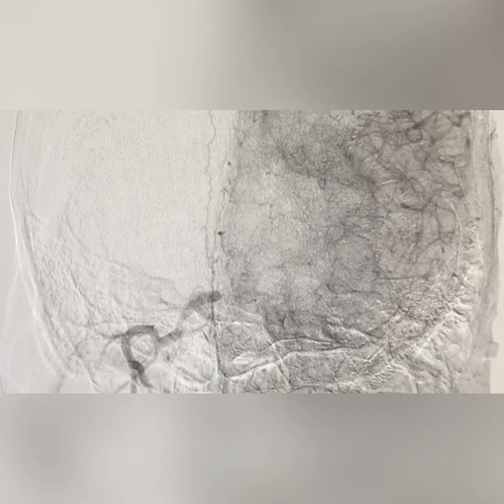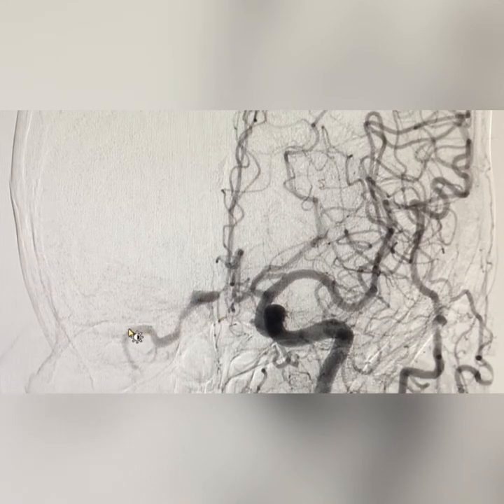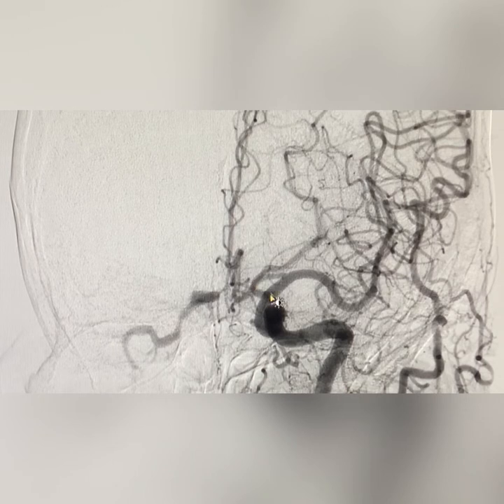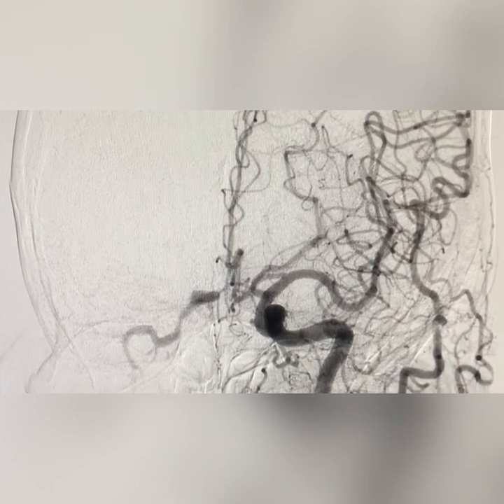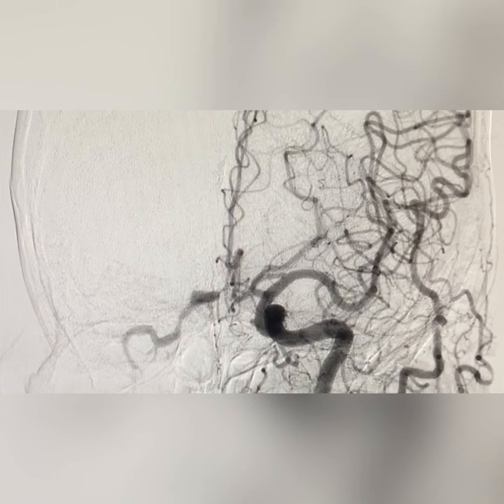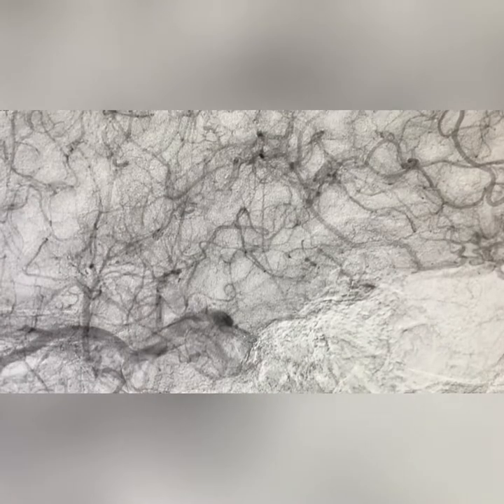We started with an angiogram of the cerebral circulation. This is the left common carotid artery angiogram, which demonstrates early opacification of the cavernous sinus, draining into the facial vein and then into the internal jugular vein. This cavernous sinus opacification is occurring through the meningeal branches of both the ICA and ECA, confirming the diagnosis of a Type 4 carotid cavernous fistula. Clinically, the patient has congestion and redness of both eyes, more pronounced on the right side, with diplopia and significant vision loss on the right. This is the lateral view of the left common carotid artery angiogram showing the opacification.